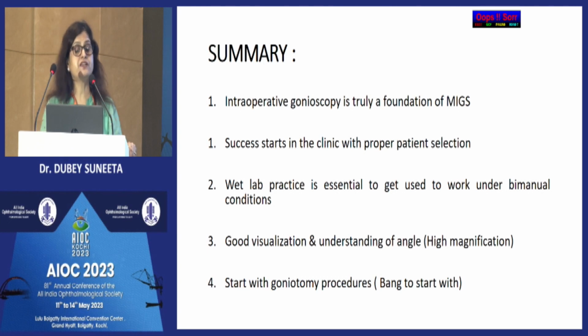So to summarize, intraoperative gonioscopy is truly a foundation for MIGS, and success starts at clinic with proper patient selection. As I said, you just have that patient selector tool, and you should document each and everything preoperatively so that you don't have any problem intraoperatively. And I would advise that you should practice these procedures in the wet lab to get used to the bimanual conditions, and good visualization and understanding of the angle is the key. To start with, I would advise that you can start with simpler procedures like BANG, and then switch over to the other procedures. Thank you very much.